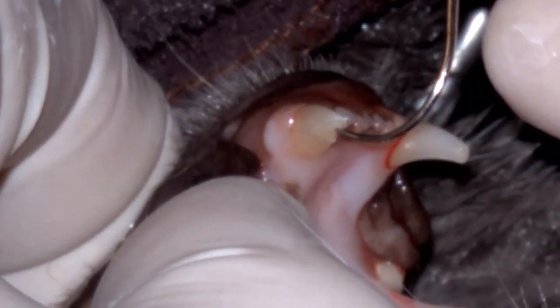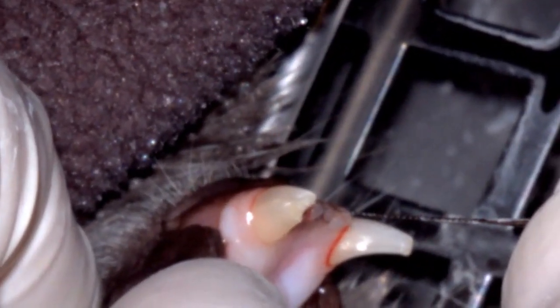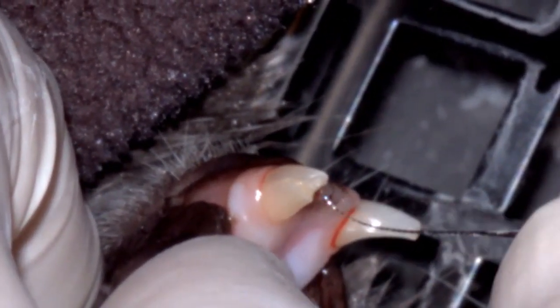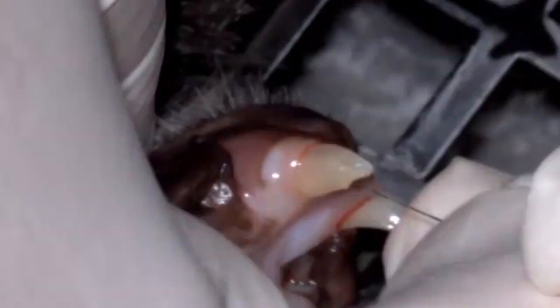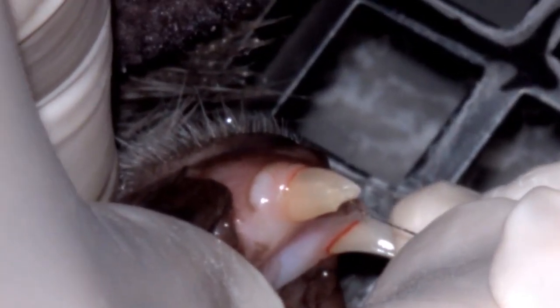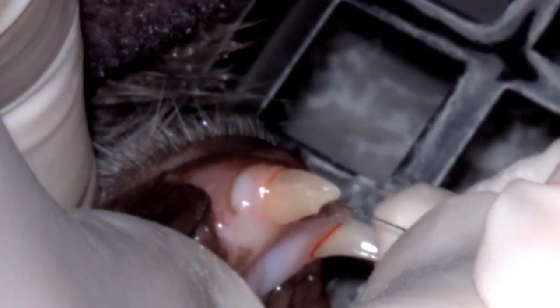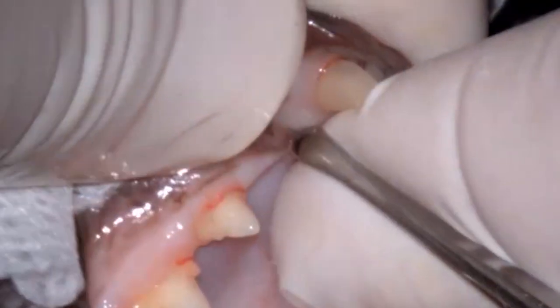At this point I have my diagnosis: the tooth has endodontic disease and apical pathology and requires extraction. It's not a candidate for root canal treatment, but just for fun I'm attempting to see if I can find actual gross pulp exposure. I probed the tooth with a dental explorer and could not get the instrument into the opening. I'm now trying a very fine endodontic file — six one-hundredths of a millimeter at the tip — and I cannot get it into the pulp chamber. So in this particular tooth there was no direct pulp exposure, just a near pulp exposure, and since dentin is porous that was more than enough to allow bacteria to get inside and kill the tooth.